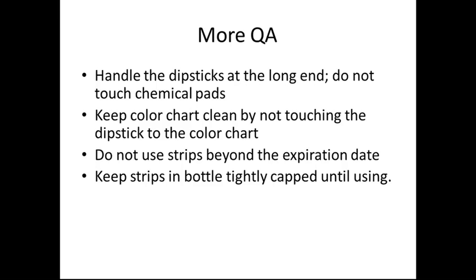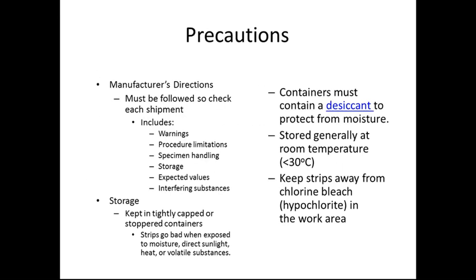Do not use the strips beyond the expiration date, and keep the strips in the bottle tightly capped until you are using them, and then replace the cap right away after you are done. Precautions must be followed. Manufacturer's directions must be followed.